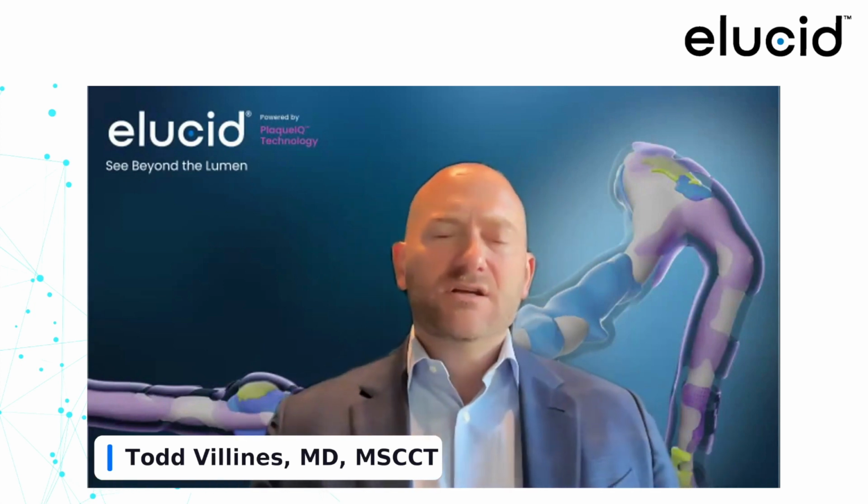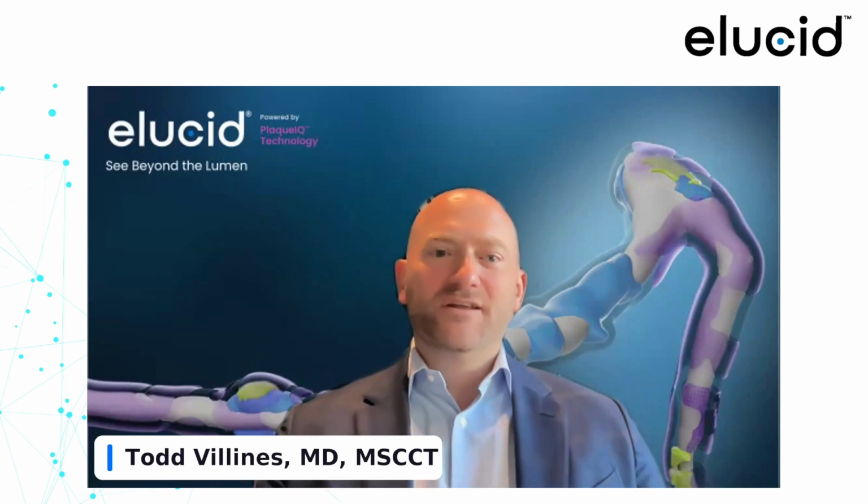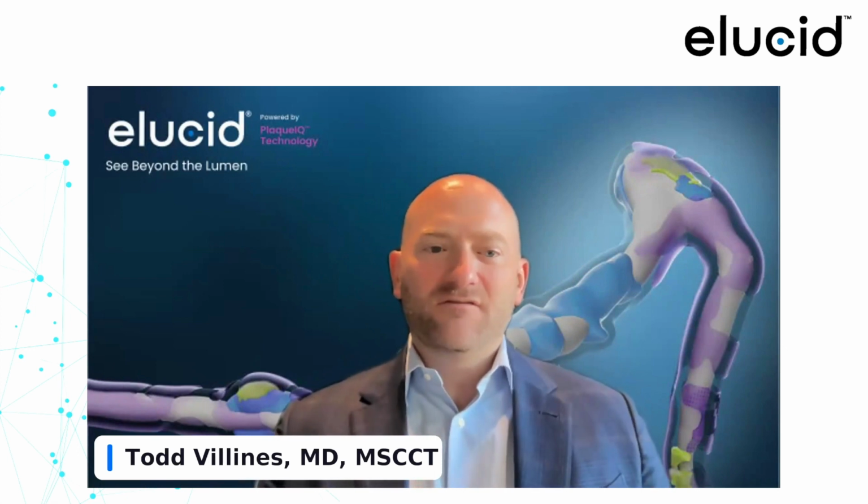We've also seen some, with certain scanners like dual source scanners in patients who aren't responsive to beta blockers, or maybe just rolled in and don't have the time to give beta blockers, even doing end-systolic imaging is another approach, and that's something that we've done at the University of Virginia, where we continue to do clinical care. But I think we always default to having good heart rate control as the best you can do it. So the importance of that is obvious.